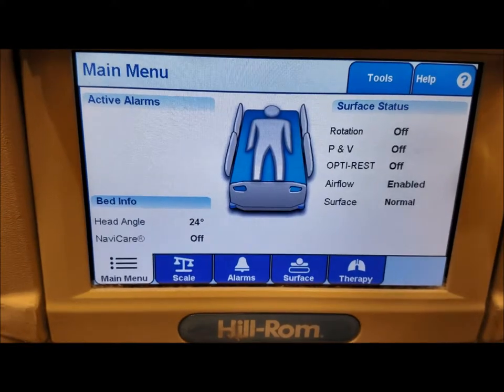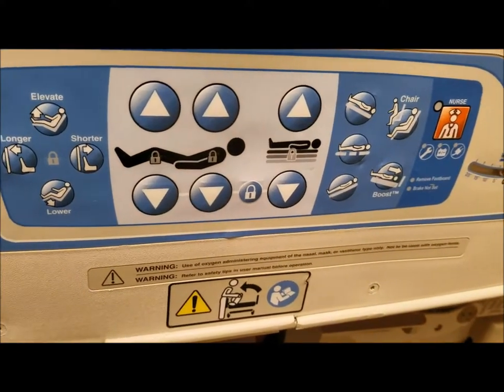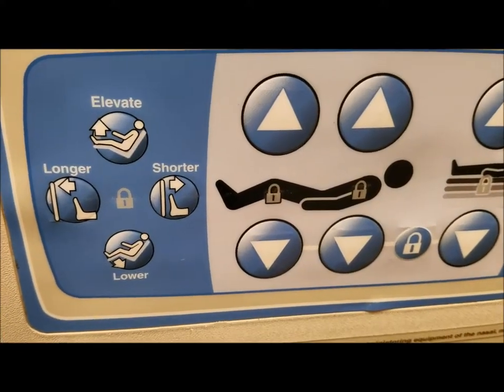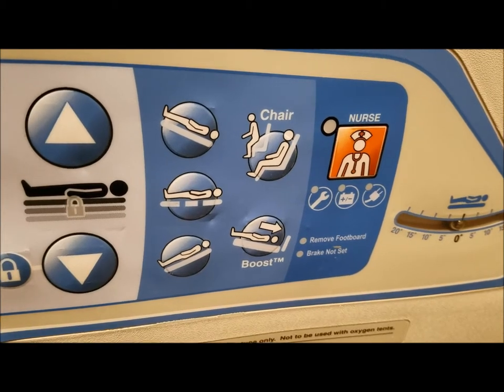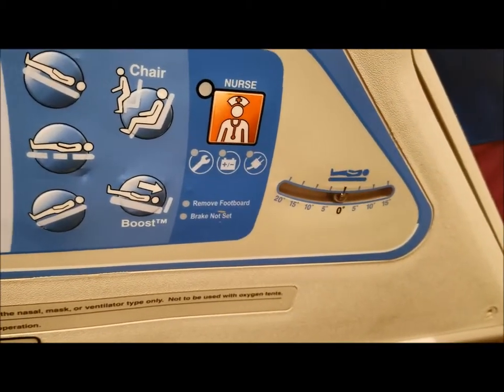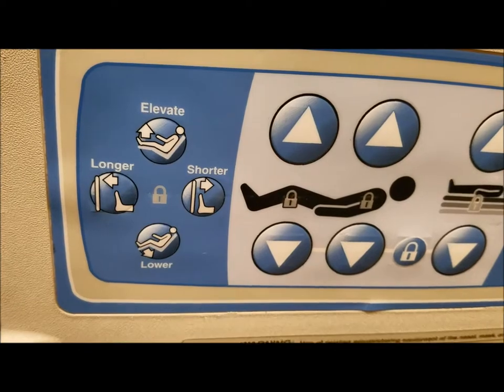As far as the patient controls go, you're going to have the patient controls right here on the side of the bed. You can lengthen and shorten the length of the bed. You got head up and down, foot up and down. You have a full chair position, and then you also have the Trendelenburg settings. You do have the ability to also gauge the degree of the turn or the degree that the head is up with the side rails.